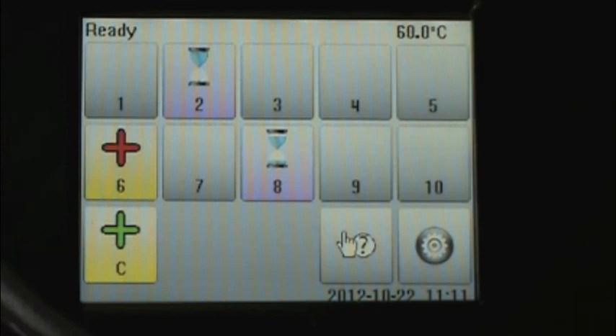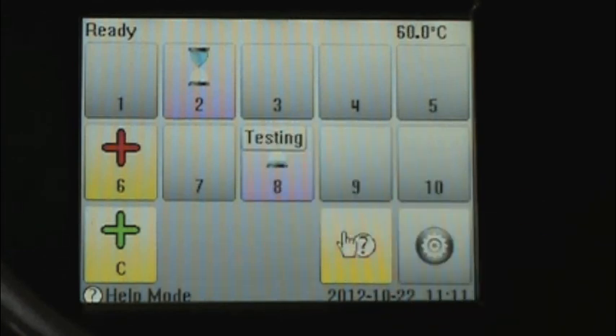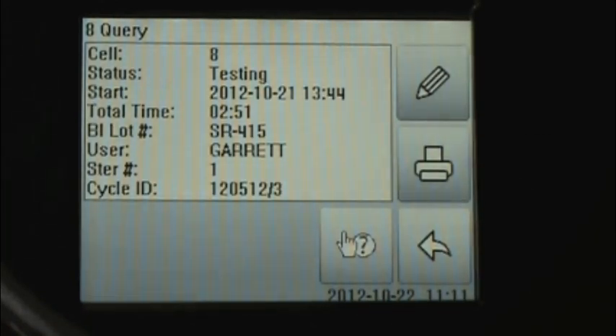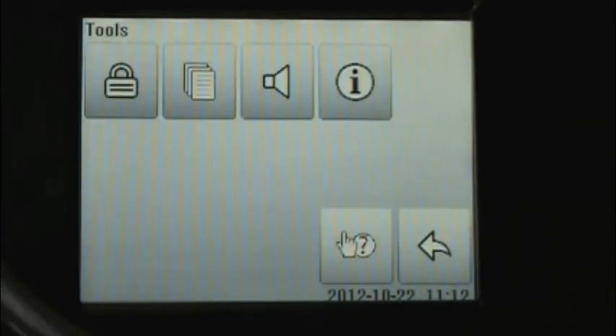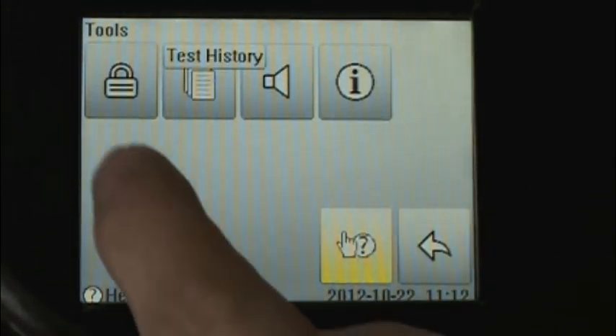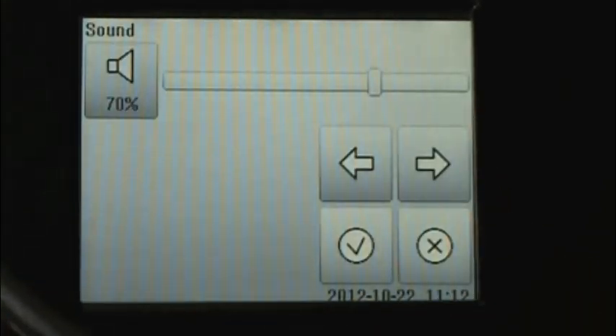The question mark icon is our help mode. Once pressed, we see that we are in help mode. Press any button and it gives you a brief description of what you're looking at — in this case, testing. If you press it a second time, it will actually take you to that screen. Here we see a status update on the biological indicator in cell number eight. Additionally, if we go to the settings menu and activate help mode, touch any icon for a description of what that icon represents. If you touch twice in succession, it will take you to that actual screen.